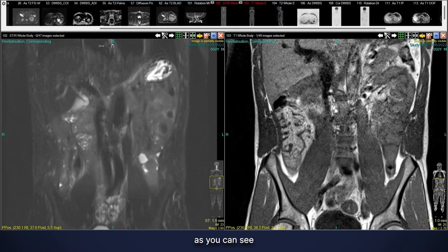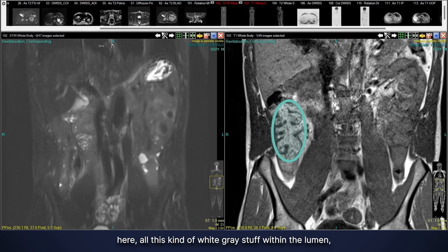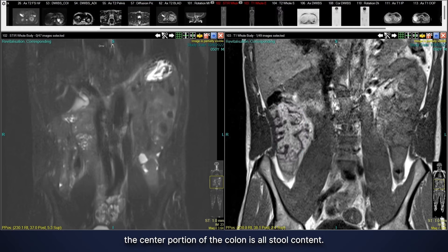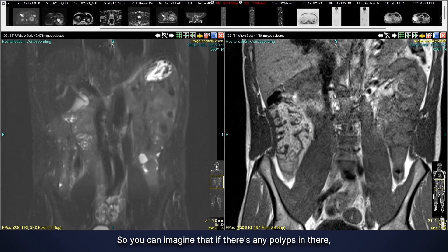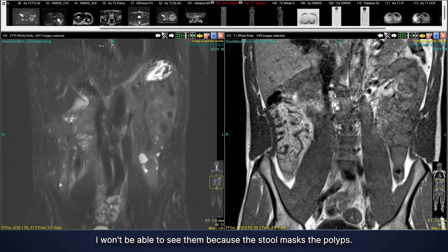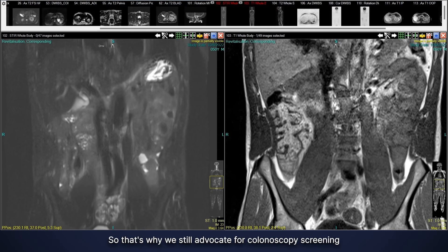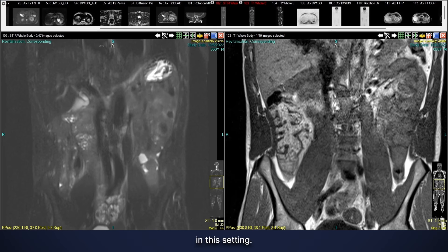We do have limitations looking at the colon on this particular exam. As you can see, all this white-gray stuff within the lumen — the center portion of the colon — is stool content. If there are any polyps in there, I won't be able to see them because the stool masks the polyps. That's why we still advocate for colonoscopy screening in this setting.